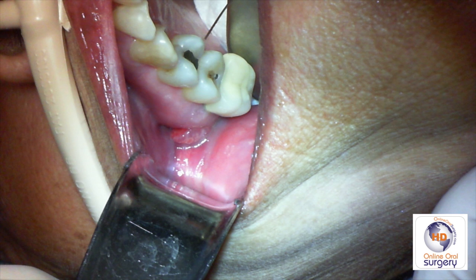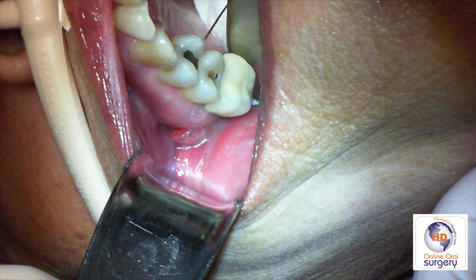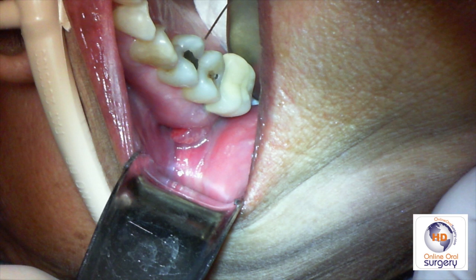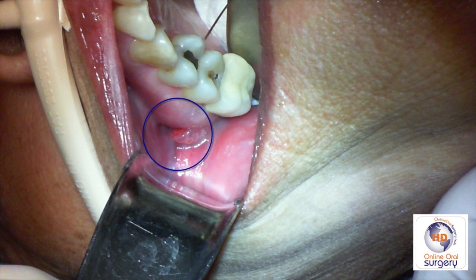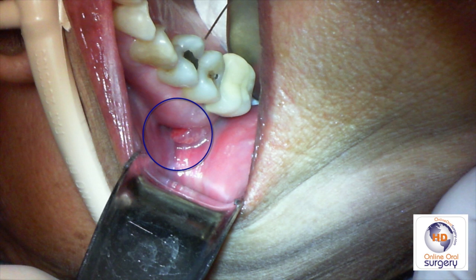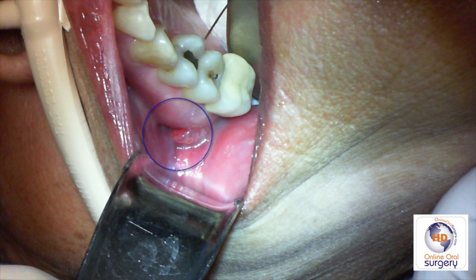Clinically, tooth number three does have a PFM crown on it and there is something that appears to be some type of flap in the buccal vestibule along the buccal alveolus.